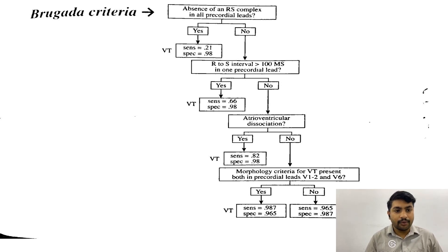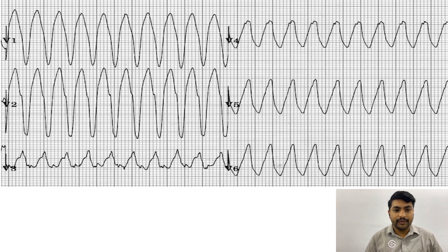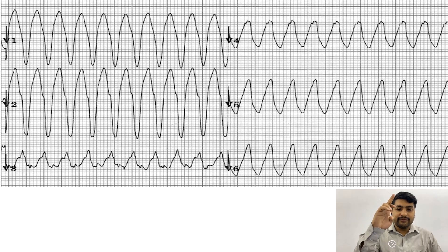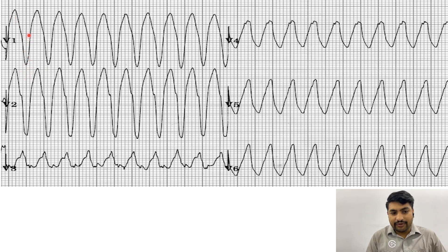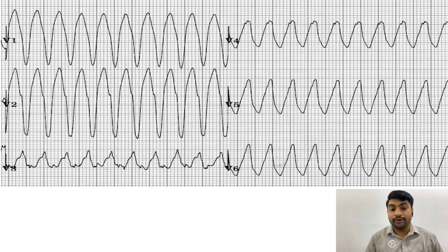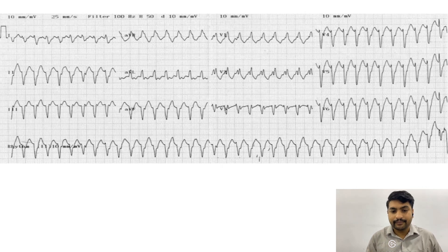This is our first ECG. Can you see that this ECG is going in one direction — either upward or downward? In this case it is going downwards. These are S complexes — a bunch of S complexes with no R wave. So on the very first step, if there is no RS complex, it is VT. This one is VT.